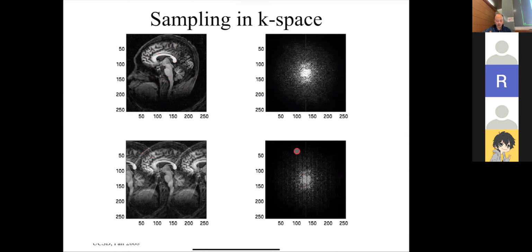And let's say I just threw out every vertical line in K-space, then you get something weird like this. We're going to find that this is a form of aliasing. So one of the design rules that we obviously need is that we don't want this to be the image. Nobody wants this. If this is the image your doctor gives back to you, you're not going to be happy, especially if they're planning on doing surgery on your head.